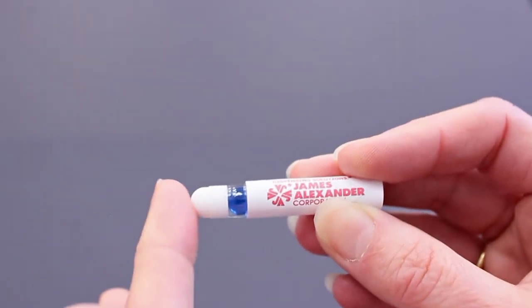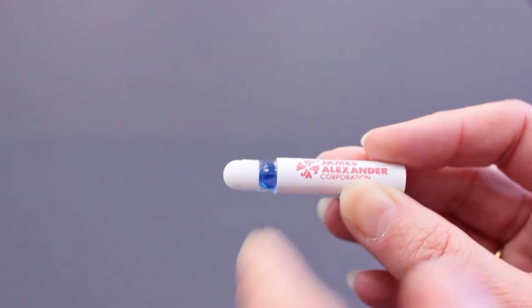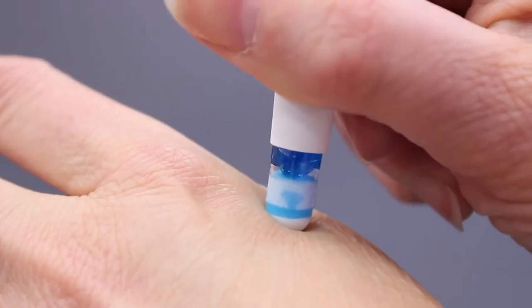The swab has a molded porous polyethylene tip and the cardboard sleeve can be printed with one color. Squeeze at the dot and apply.